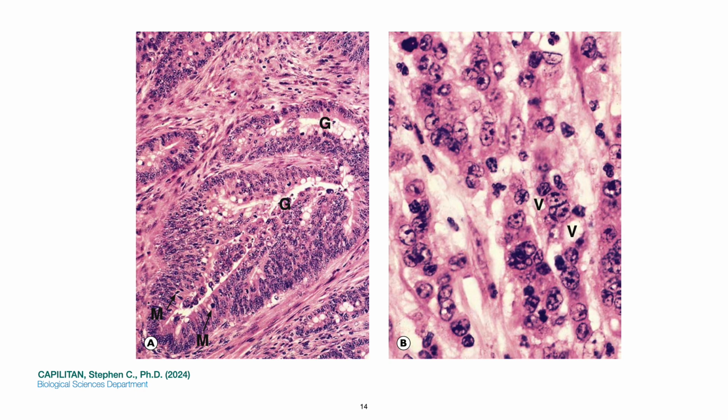This is colonic adenocarcinoma. In letter A, it is well differentiated in medium power. Letter B is poorly differentiated in high power. Carcinomas that derive from the surface of glandular epithelium, such as the colon and stomach, tend to exhibit a glandular pattern of growth and are known as adenocarcinomas. The same is true of carcinomas arising in solid glandular tissue, such as the kidney, the breast, and the prostate, and of the tumors of the liver, which in embryological terms develops as an outgrowth of primitive gut epithelium.